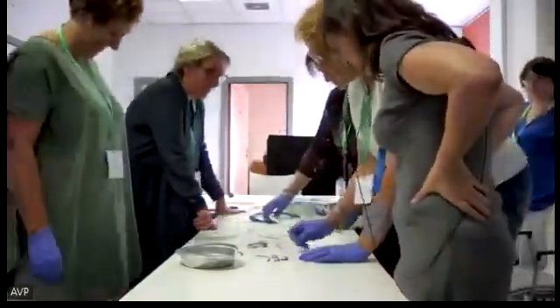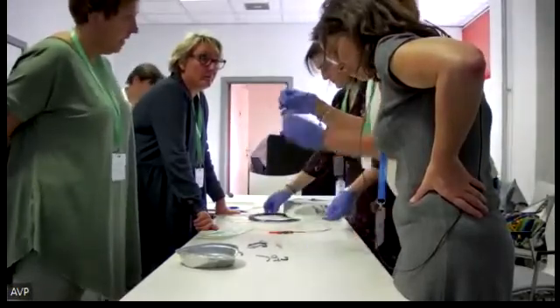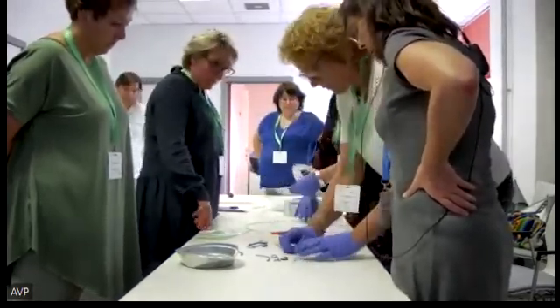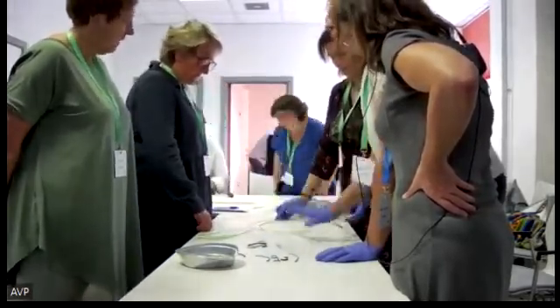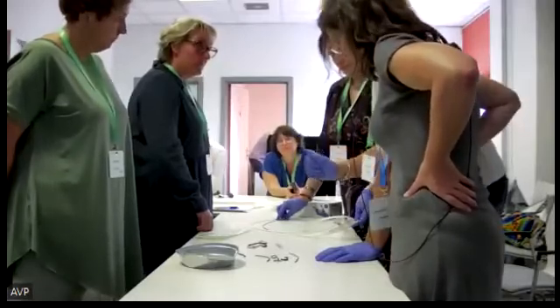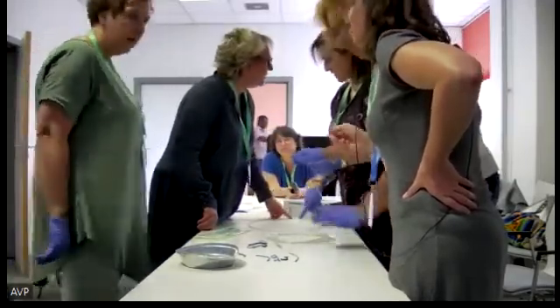So if we put a stent to avoid acute pancreatitis, we cut the distal flap, or we buy one designed for that. For using the fusion system, it's better to use an 8.5 French stent, not the 10 French, because it's very hard on the duodenoscope. Well, this one is a 10 French, just to show you. That's why it's here, because we don't use it.